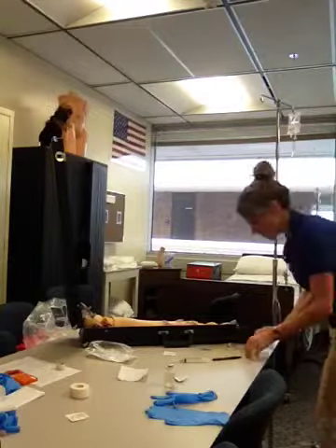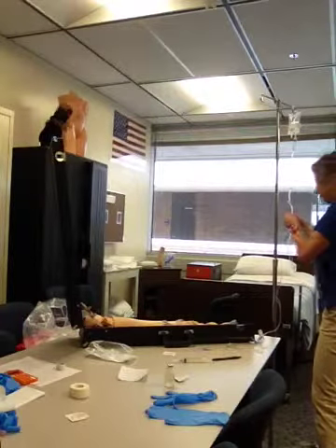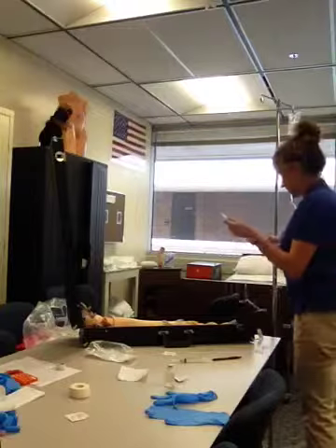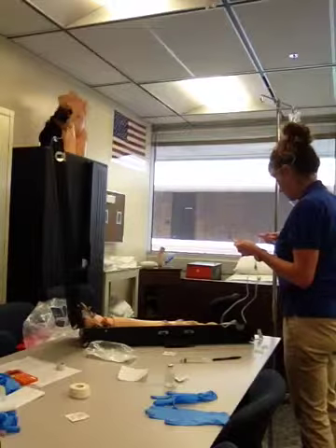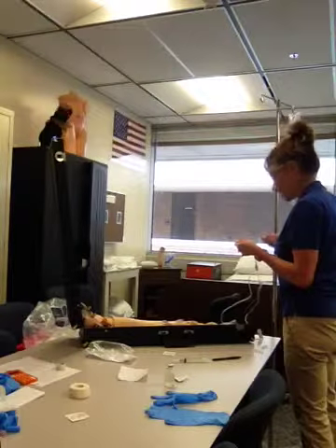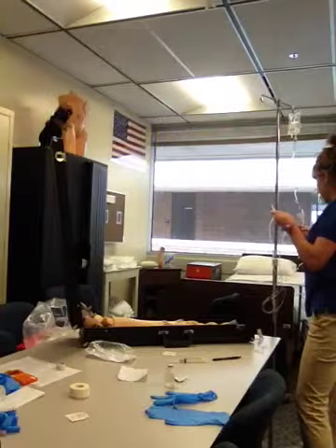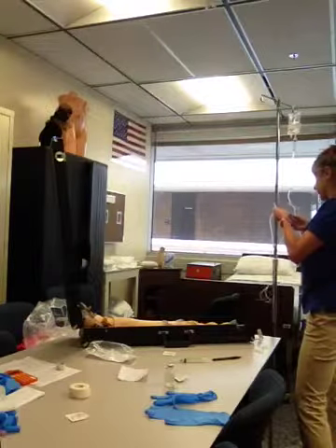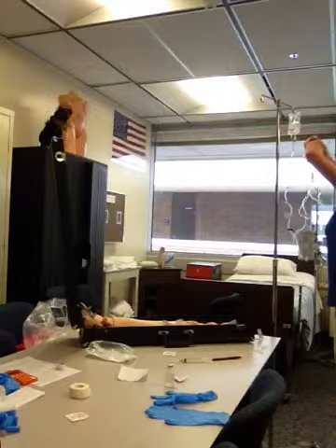Okay, and I'm going to label my tubing, my name, the time, and the date. Okay, and then I'm going to prime my tubing to the end and clip it off. Is ready for our patient.